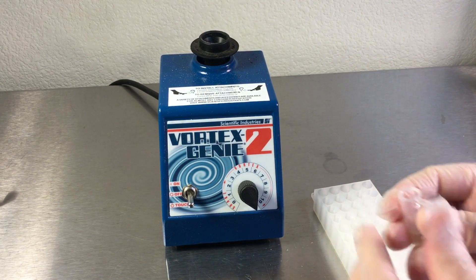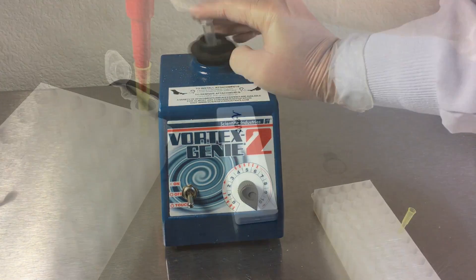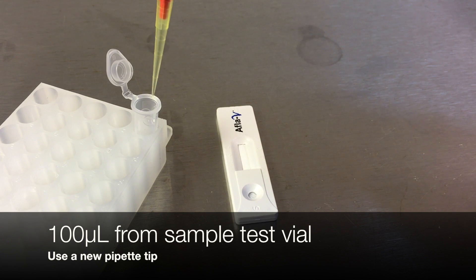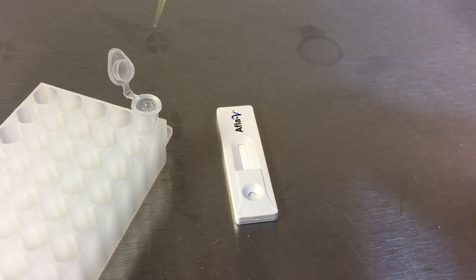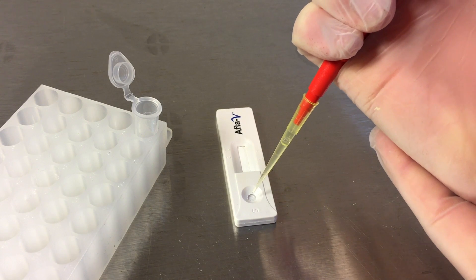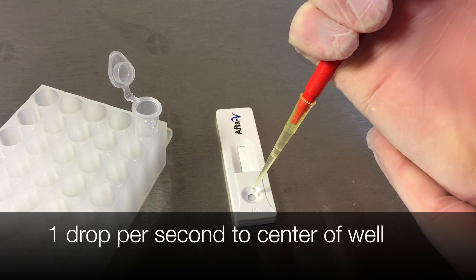Seal the vial and mix well by vortexing. With a new pipette tip, transfer 100 microliters of diluted sample to the well of the AFLA-V strip test. Drop one drop per second to the center of the well. Tap the edge of the well with the pipette tip to get the last drop of sample.